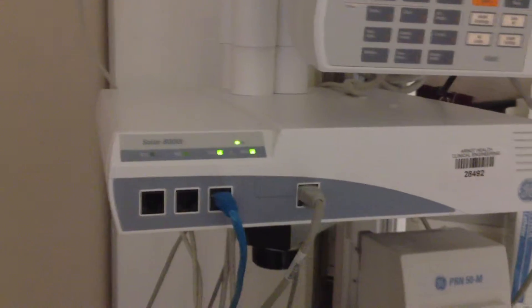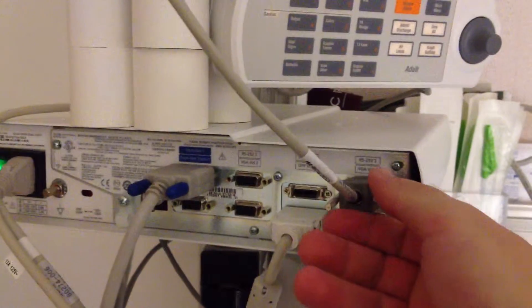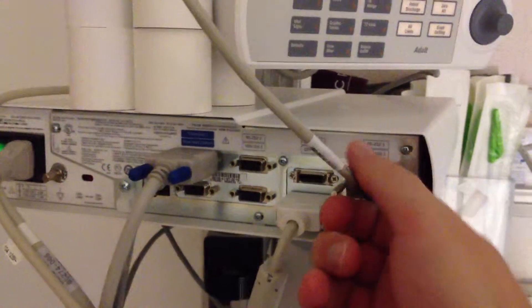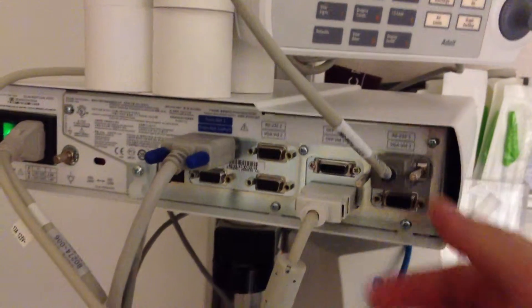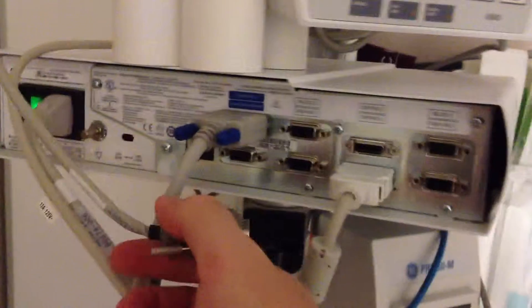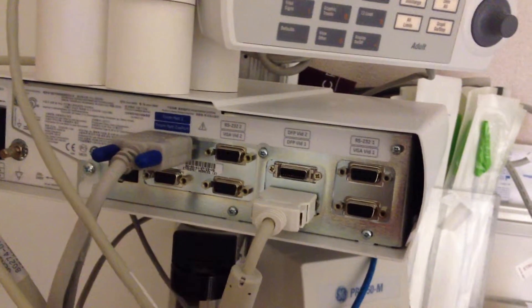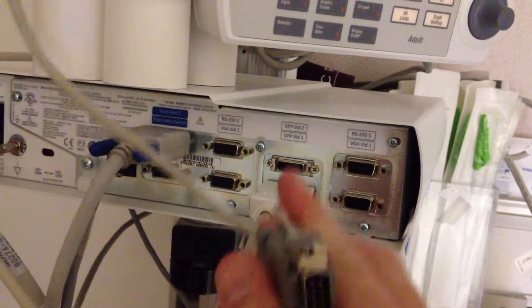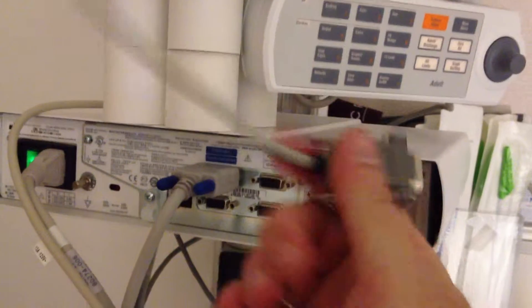Solar 8000i by GE. We're going to turn around the device to look at the RS232 COM port — RS232-1. It is a 9-pin female port, and that plugs into, of course, a 9-pin male port.